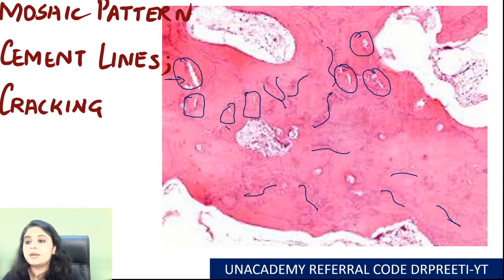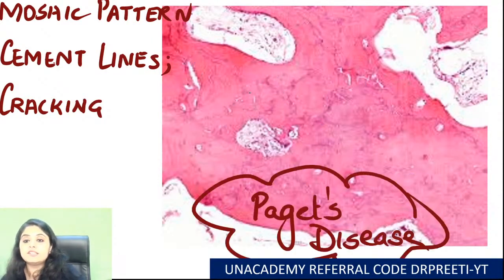Which disease am I talking about? Come on, everyone needs to know this. This is the first disease that we study under bone. It was non-tumorous, so I put it up in the end. What is that? No answers up till now? Very good. Got the answers, Dr. Rahul, Dr. Pooja. Paget's disease, guys. Paget's disease.